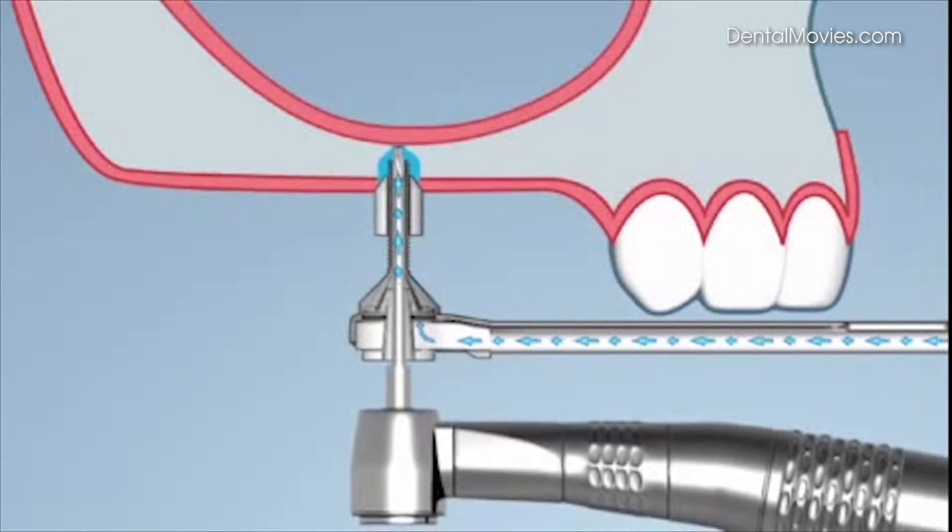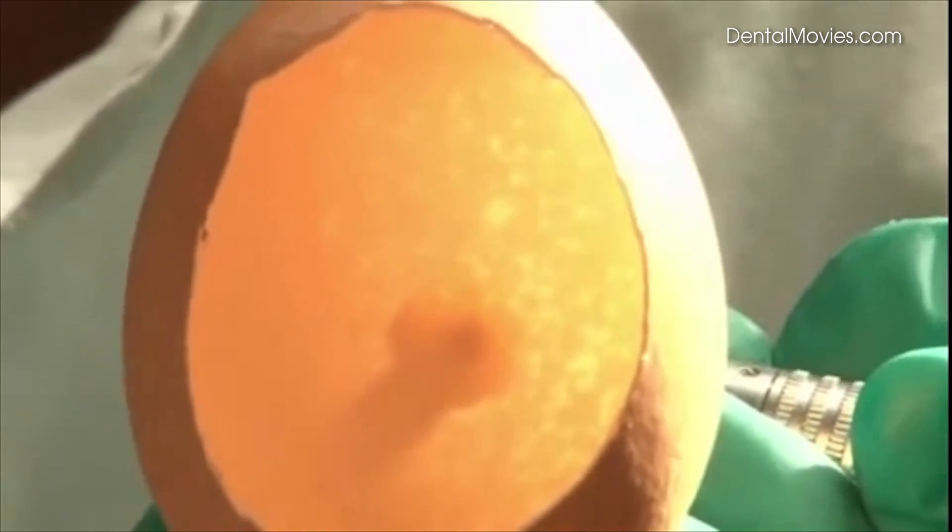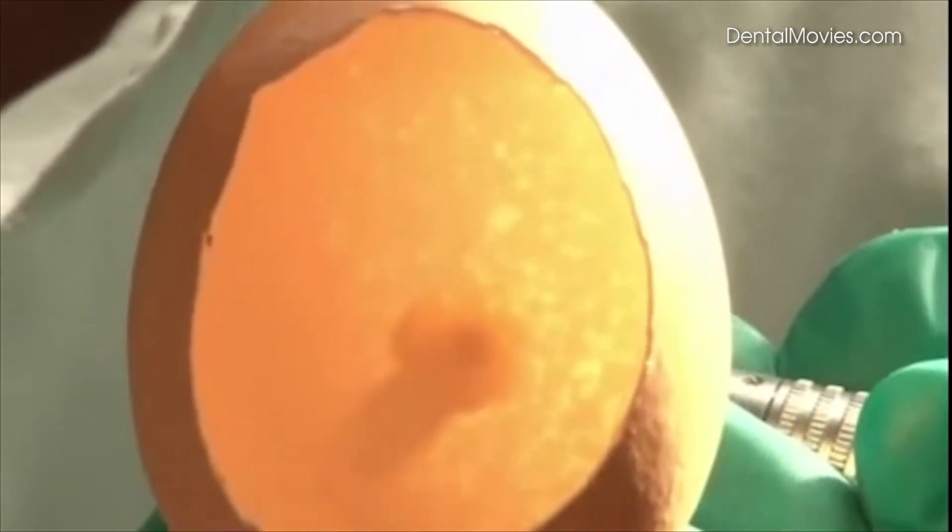The high pressure pushes the membrane away from the drill. The membrane remains unscathed because the drill cannot reach it. The egg model shows how the membrane is pushed away from the drill.